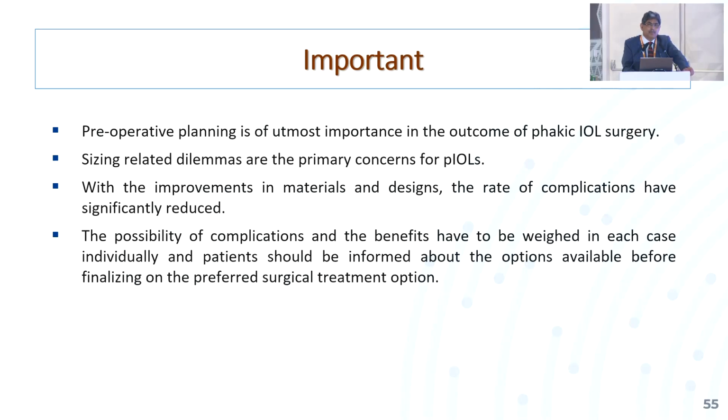Development of cataract post Centraflow lenses has decreased markedly, and even with 0.25 millimeter vault, we have seen that there is no development or minimal development of cataract. The possibility of complications and the benefits have to be weighed in each case individually, and patients should be informed about the options available before finalizing the preferred surgical treatment option.